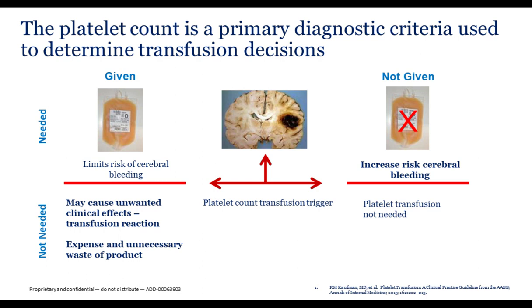Ability to count giant platelets, again, could be variable. So from a low level of accuracy, it's limited to about 10,000, or that transfusion threshold that most laboratories would use. More reliable than impedance, but you still would need to review the smear. And of course, the immunoplatelet count, as we reviewed, has virtually no interferences across most of the primary interfering substances. It's accurate, believe it or not, down to about 1,000, and certainly is the method of choice, and is why the ICSH considers it the reference method.